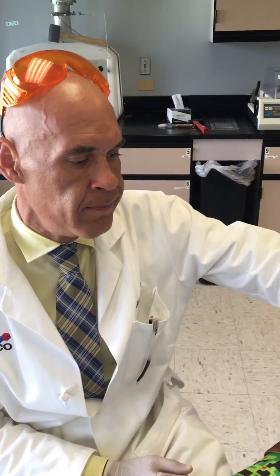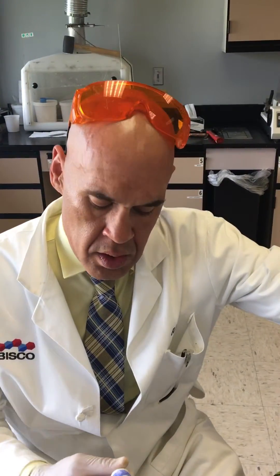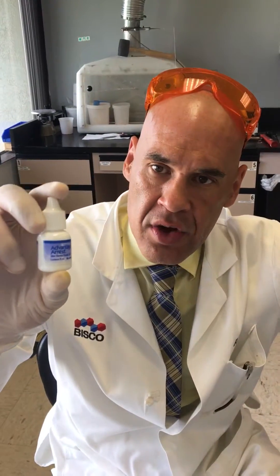Dr. Gannon, how you doing? Look, I just found something really interesting. So we're going to do the Advantage Arrest — the bond strength test you wanted us to run. And I want to show you this. This is really, really cool.